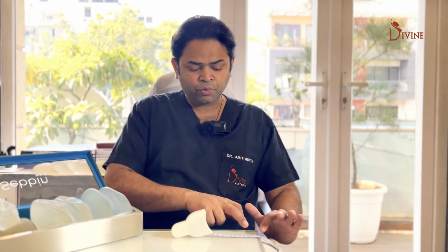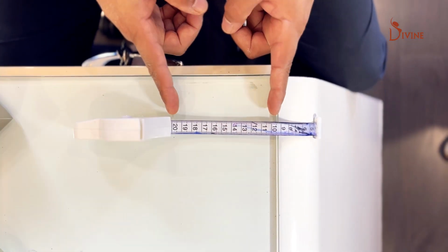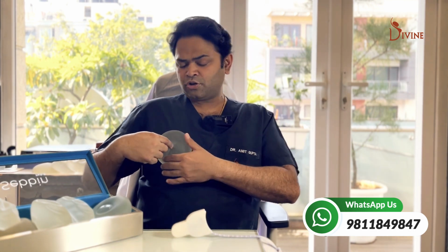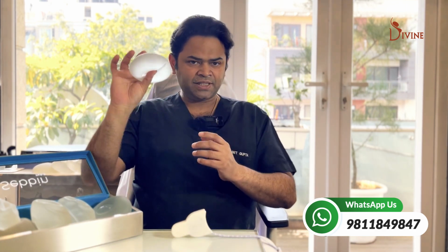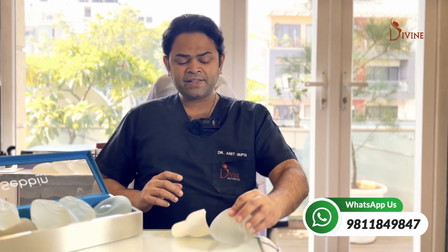Now, I've put the tape here at 10 centimeters. I'm assuming that the base diameter is 10 centimeters because any implant will sit on the chest, and this implant has to be on the breast, and the center of the implant has to be the nipple region. Therefore, if this diameter is 10, then we see this as base 10. We place the implant here.